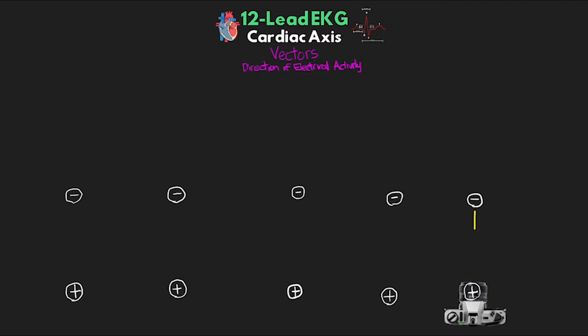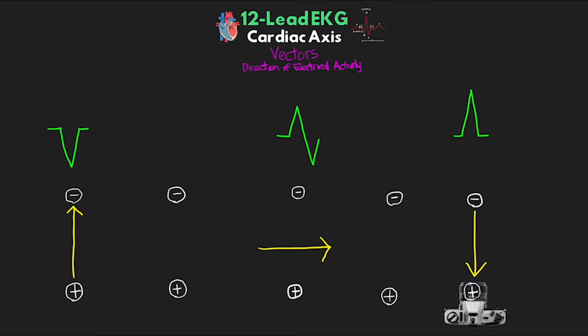If the electrical activity is moving directly towards this camera, aka positive lead, then we would see a completely positive waveform. On the flip side, if the electrical activity is moving directly away from our lead, then we're going to see a completely negative waveform. Now, if this electrical activity happens to move perfectly alongside or perpendicular to this lead, then we would see it going both towards and then away, giving us a waveform that is both positive and negative, and equally so. So these are the basic concepts of how these waveforms will look.